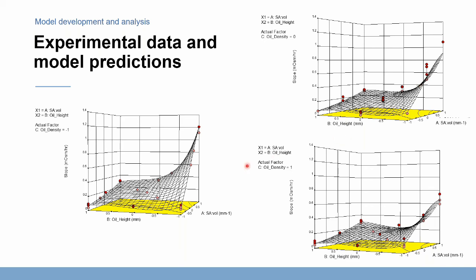And so it really took the cubic model to fit this rapid increase in slope we see here on the edge. And another thing I should say, and I try not to pretend I know everything because I don't, is that it would be interesting for me to understand a bit more about how I would do what was suggested in the comment and take the mean squared error, for example, into account.